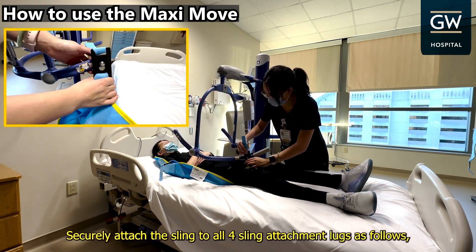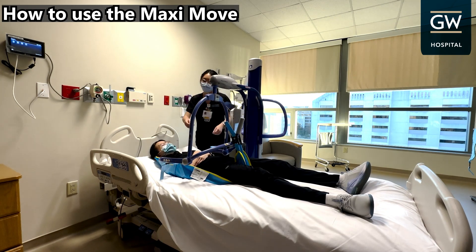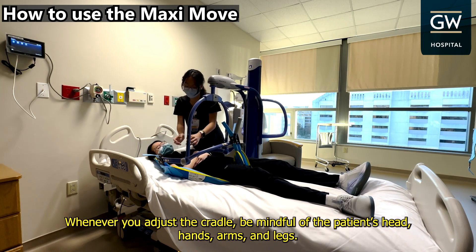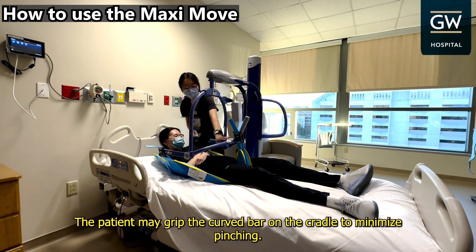Securely attach the sling to all four sling attachment lugs: two on the left, and two on the right. Whenever you adjust the cradle, be mindful of the patient's head, hands, arms, and legs. The patient may grip the curved bar on the cradle to minimize pinching.